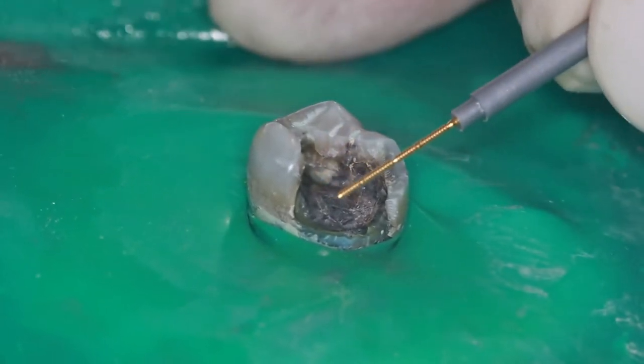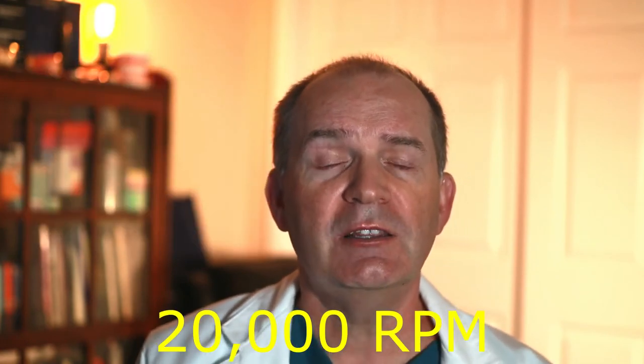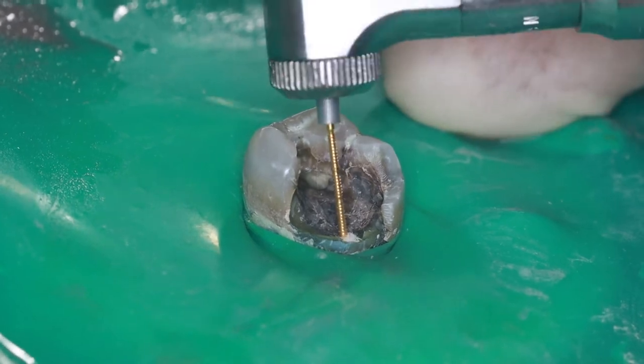I have the hole drilled in the right spot and nothing bad has happened. Next step is to place the pin. The pins I use are made by Colteen Whaledent — they are gold-plated stainless steel and come on a carrier that I use in my slow speed drill. Each carrier has two pins attached to it, and the pin will shear off the carrier once it hits the bottom of the hole I drilled. I can use my drill at its normal slow speed of around 20,000 RPM, but the pin manufacturer recommends a slower speed, so I use a torque multiplier which slows the drill down to about 5,000 RPM.